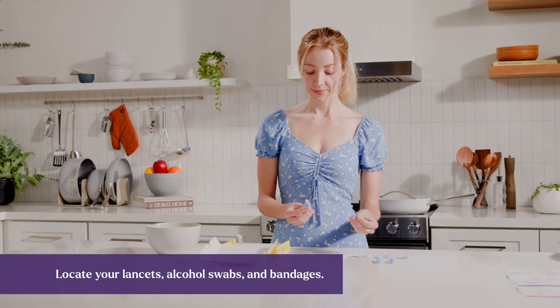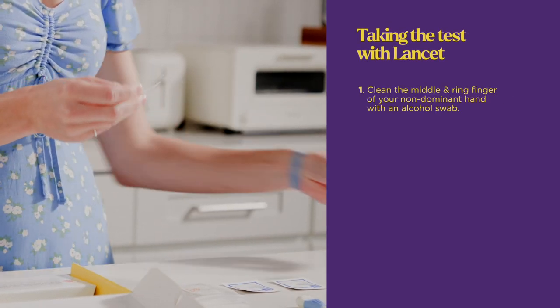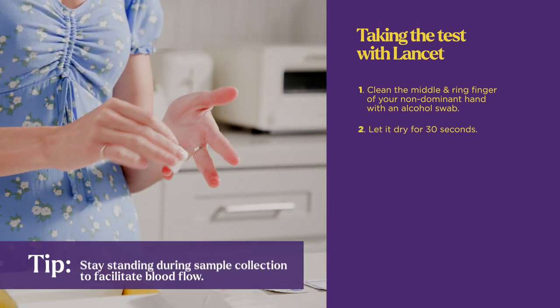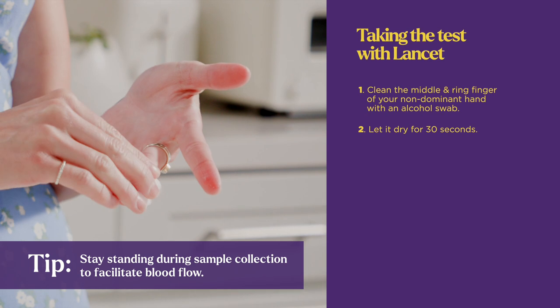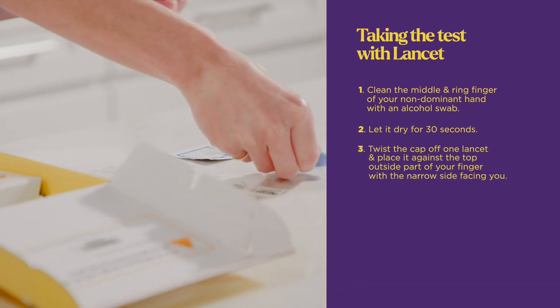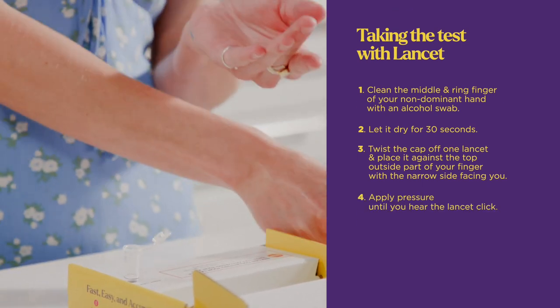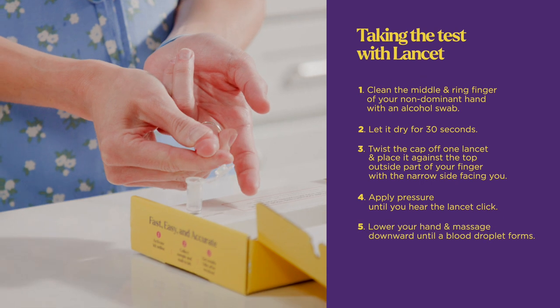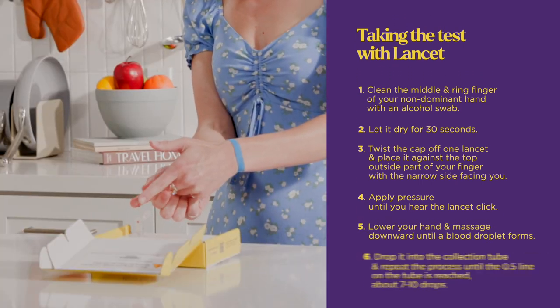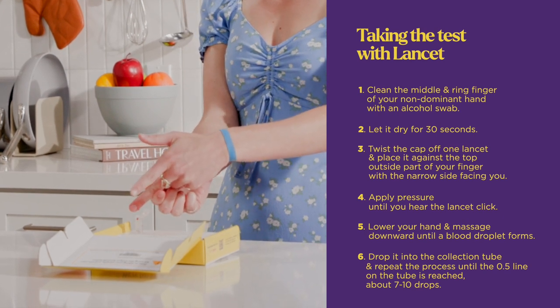Locate your Lancets, alcohol swabs, and bandages. Clean the middle and ring finger of your non-dominant hand with an alcohol swab and let it dry for 30 seconds. Twist the cap off one Lancet and place it against the top outside part of your finger with the narrow side facing you, and apply pressure until you hear the Lancet click. Lower your hand and massage downward until a blood droplet forms. Drop it into the collection tube and repeat the process until the 0.5 line on the tube is reached, about seven to ten drops.